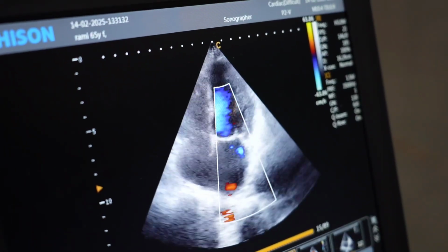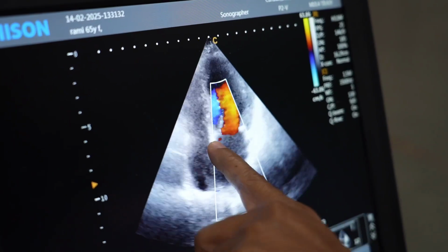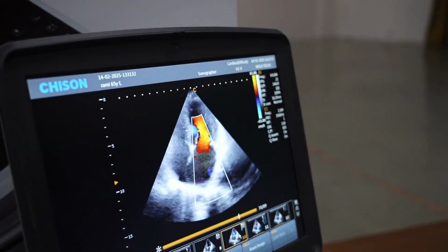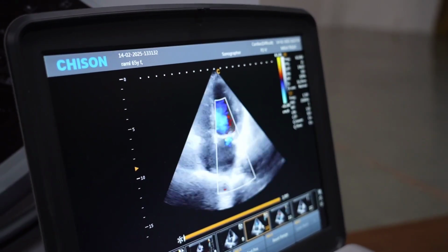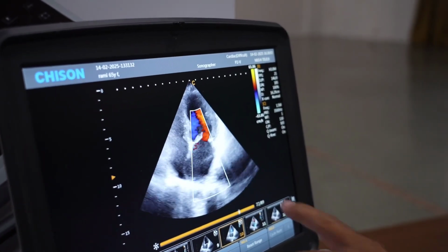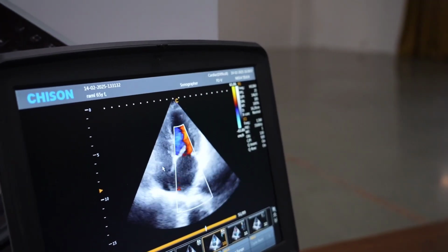All these things, along with the changes of a dilated left atrium, deviated septum to the right, a big left atrium, were signaling that the patient has severe mitral regurgitation. Hence, it was causing all the back pressure changes and the patient was having breathlessness. Remember, this jet is after the patient has been treated. Earlier on, this jet was massive.